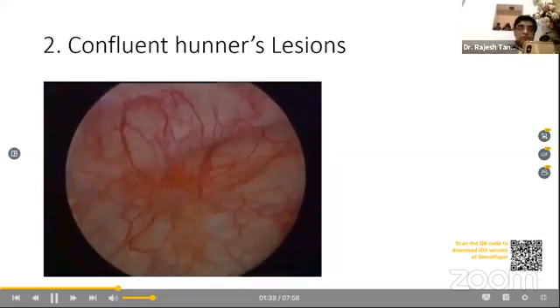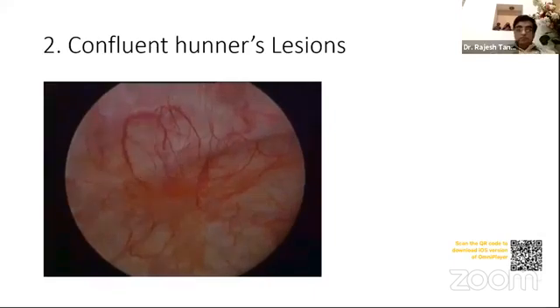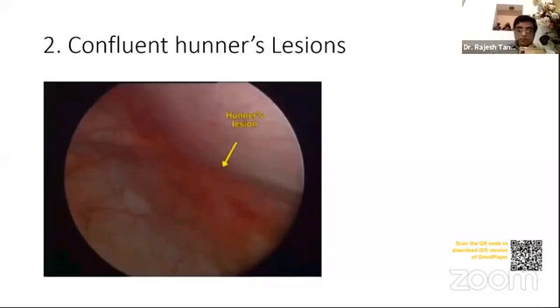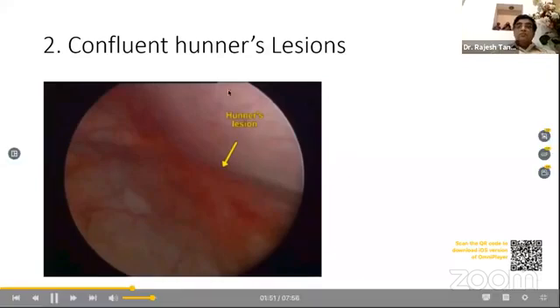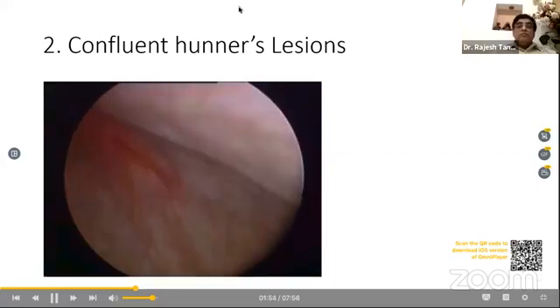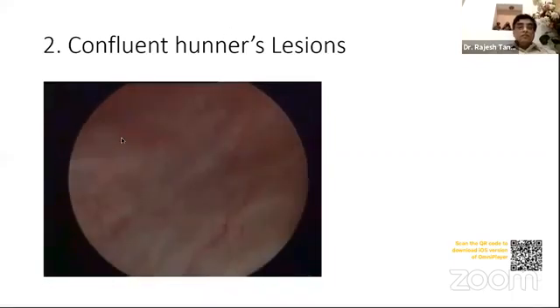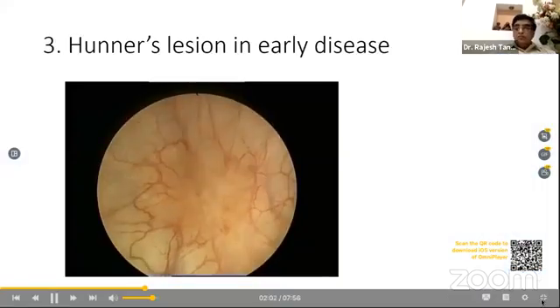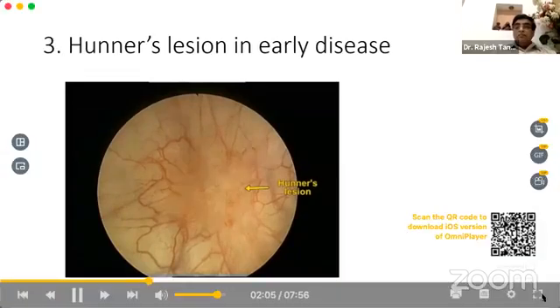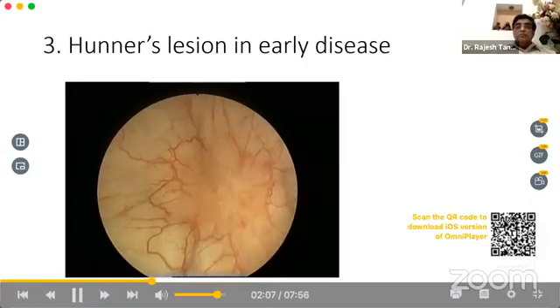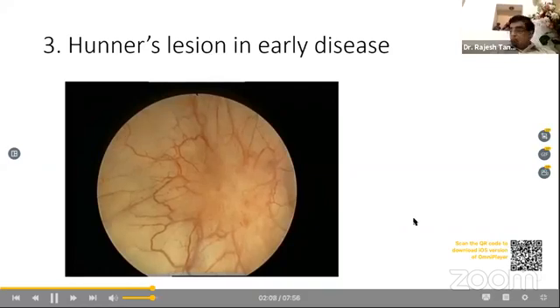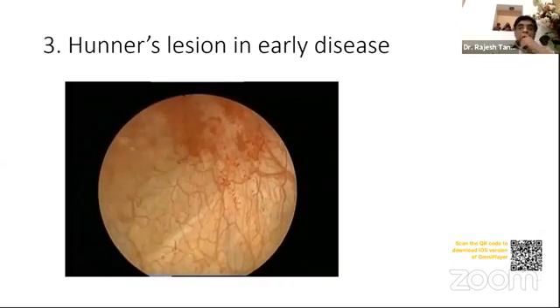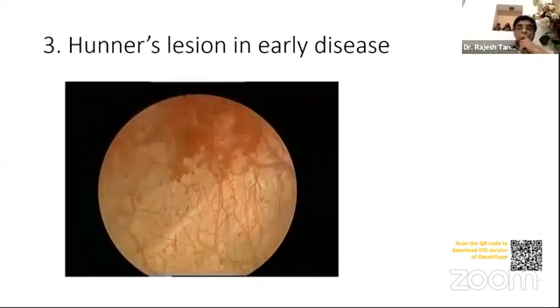This is a slightly longer-standing disease. Note that the lesions are more erythematous and there appears to be a tendency for confluence. In another case of early Hunner's lesion, note that after hydrodistension, draining of blood occurs only from the center of the Hunner's lesion and nowhere else in the bladder. This is characteristic of early disease.